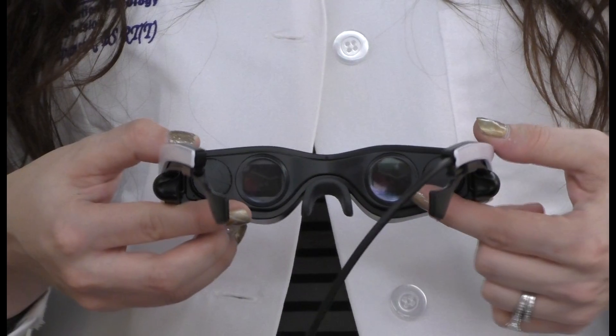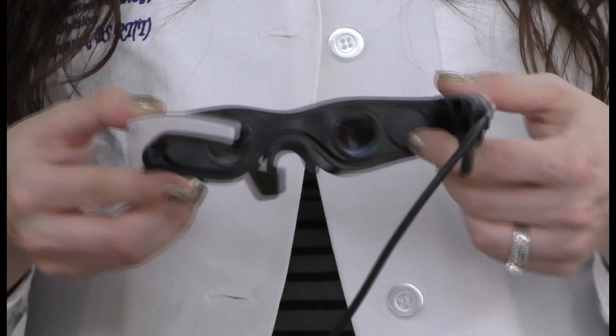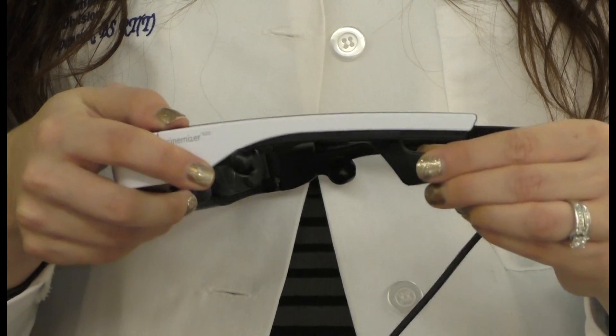Close one eye and adjust the dial as desired, then repeat with the other eye. The goggles' earpieces are also individually adjustable for a comfortable, perfect fit.